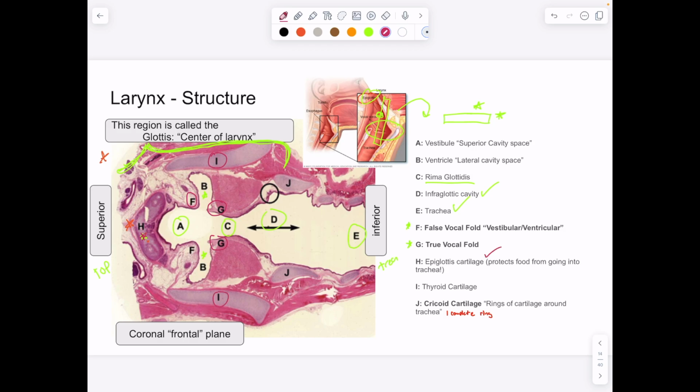So we have thyroid cartilage, and you can see part of the thyroid gland right here overall. All right, so then we have one last cartilage, the cricoid cartilage, which is right here. As we'll see as we get into the trachea, the cartilage deep to this is going to be C-shaped. The cricoid cartilage is a complete ring, right? It's one complete ring. This is the cricoid cartilage.